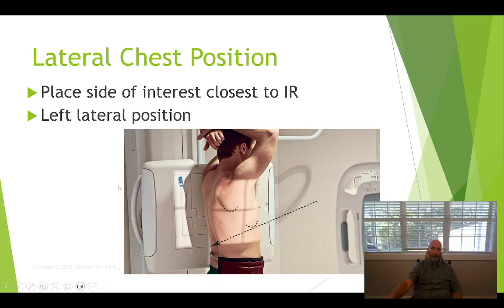Most of the time we're going to do left lateral. Don't forget to put your side marker on the image, but also make sure that it's not in the anatomy. So they could have collimated down on this a little bit, and then moved that marker in somewhere that it would still be in the light field, but not in the anatomy itself.